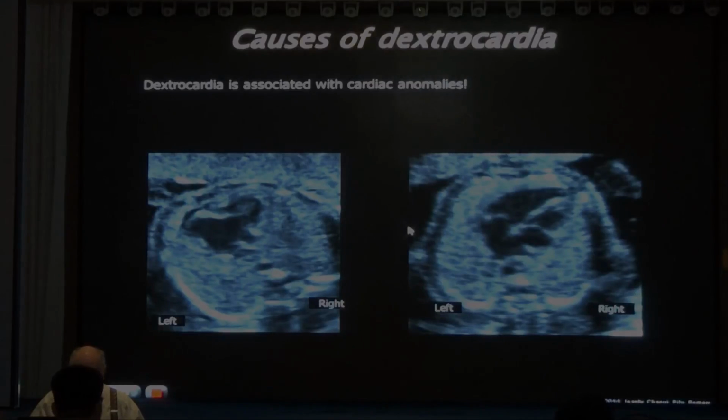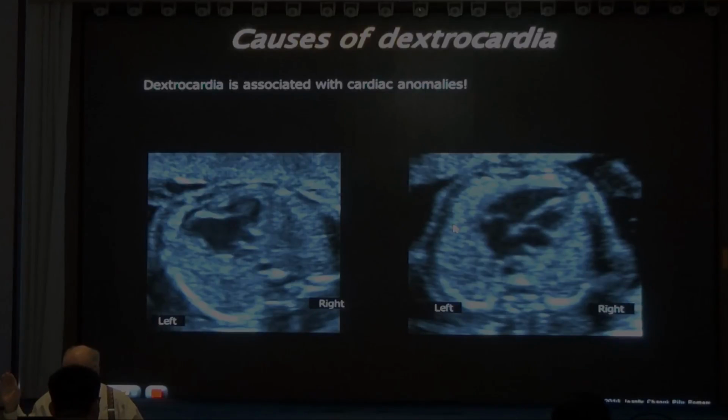It's Friday, 5 o'clock. You have to go get your children at the daycare center, and you see this picture. This is the left side, this is the right side, 4 chamber. Normal? Not normal. Which of these 2 ventricles is the longest? The front one. So the front one is the left ventricle. This is the moderator band, so this is the right ventricle.